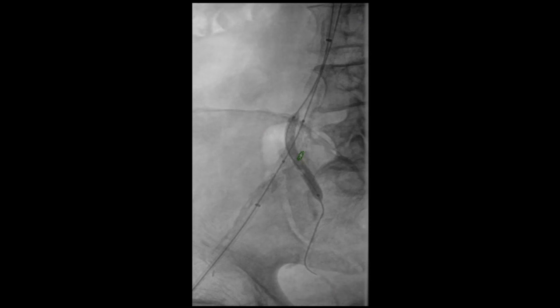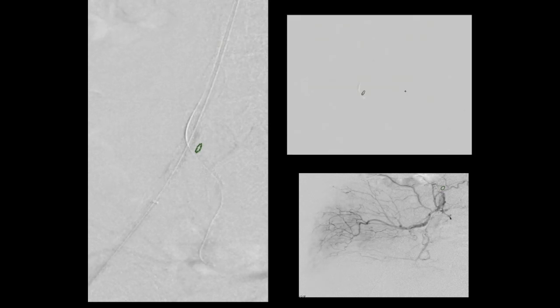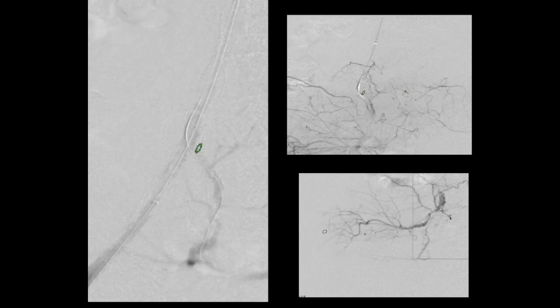Once the balloons were deflated, we did a completion angiogram which showed fairly good flow both in the internal and external iliac array. The balloon is being deflated and withdrawn. We initially shot retrograde — you can see it actually filling the internal and the external. We were particularly interested in looking at the flow into the buttock and the cross-pelvic circulation, and it seemed to be very brisk. In follow-up, the patient has completely resolved his bilateral buttock claudication.